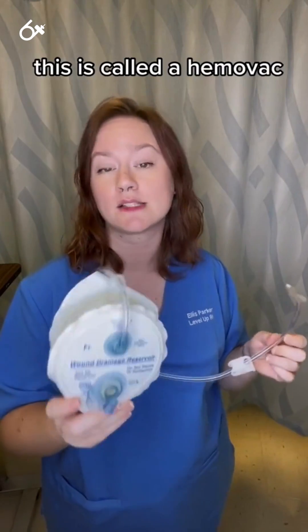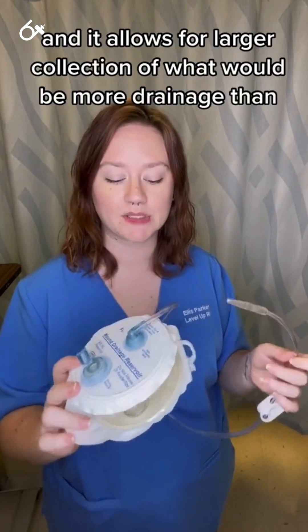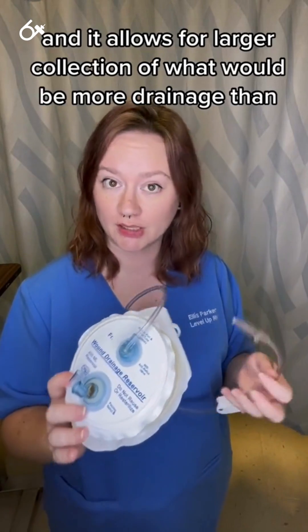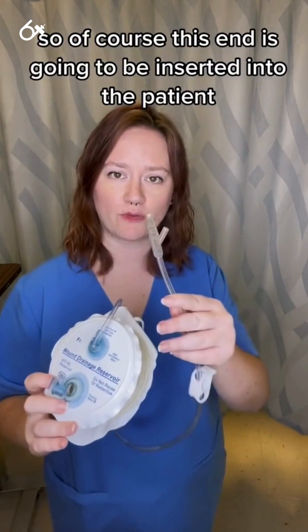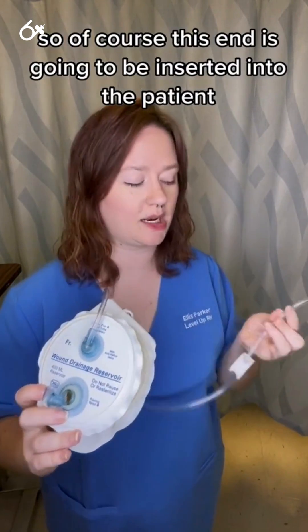This is another closed drain device called a HEMAVAC. It allows for larger collection of drainage than a JP drain would handle. This end is going to be inserted into the patient.